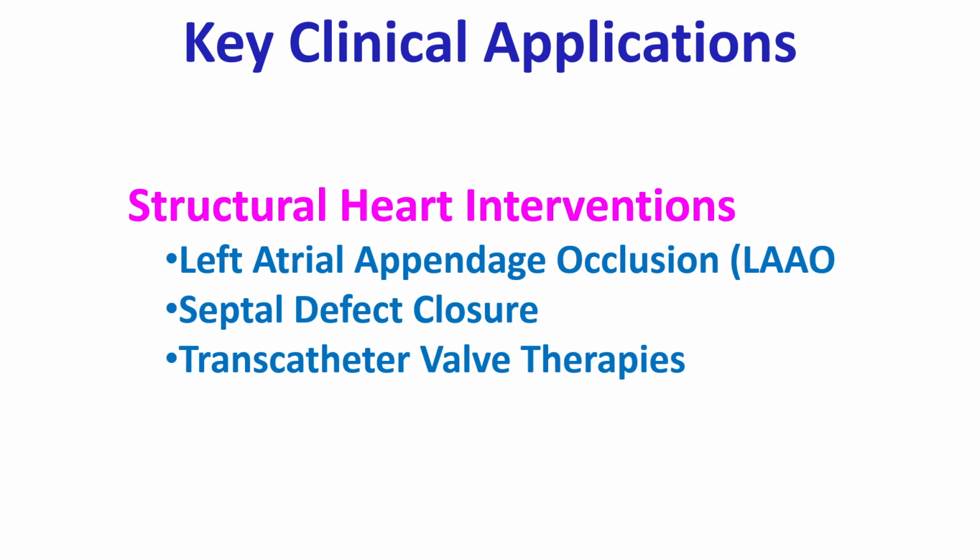Structural heart interventions. Left atrial appendage occlusion, used to size the appendage, guide device deployment, and assess for residual leaks. Septal defect closure guides the deployment of occluders for secundum atrial septal defects and patent foramen ovale. Transcatheter valve therapies, increasingly used as an alternative to transesophageal echocardiography during transcatheter aortic valve replacement or transcatheter edge-to-edge repair to monitor positioning and immediate hemodynamics.